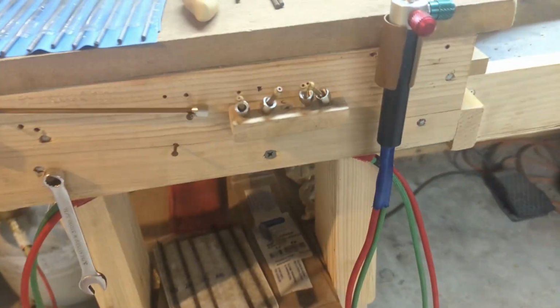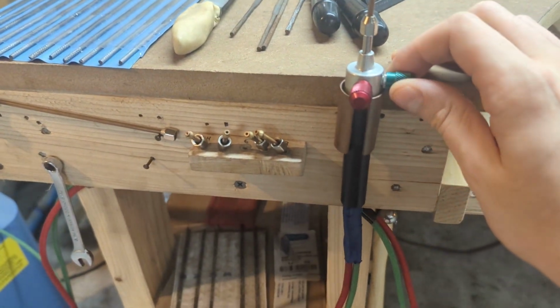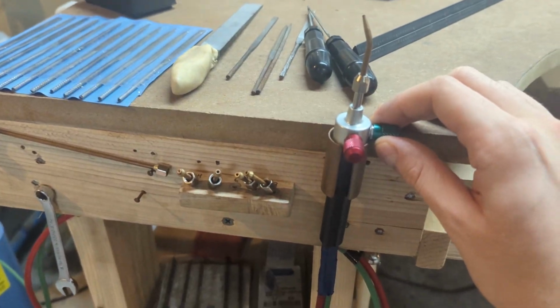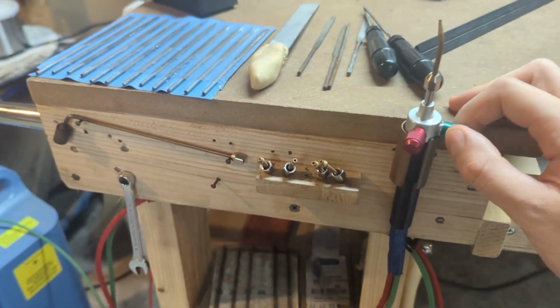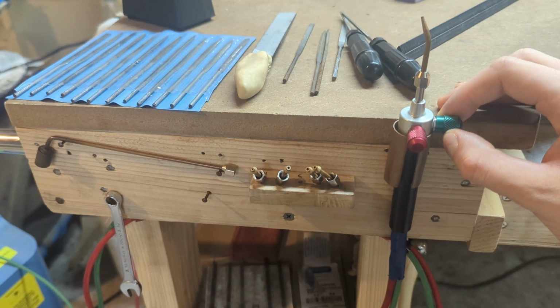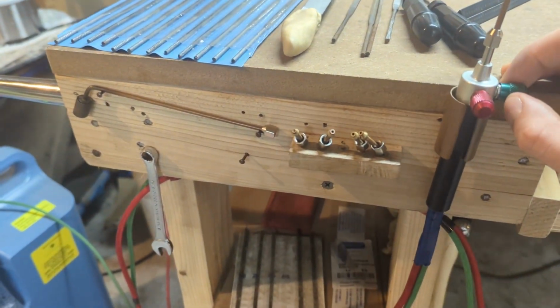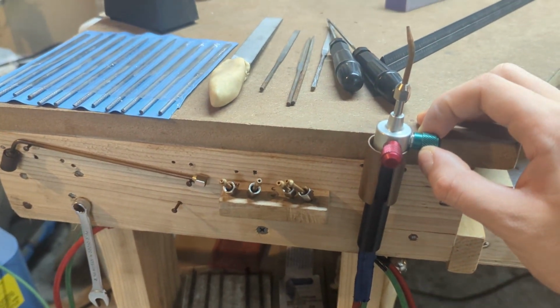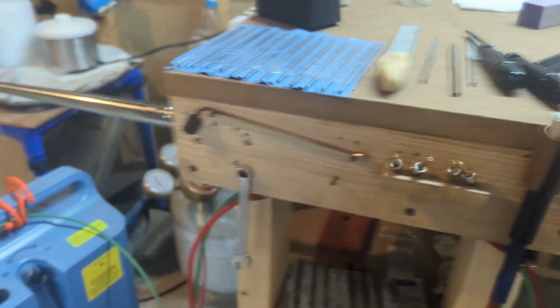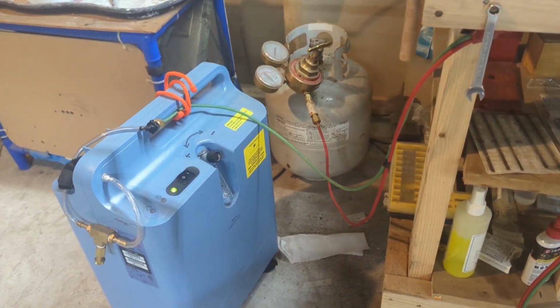And it's just overall bad. That's really a problem when you're making jewelry, because you can't have the oxygen closed for extended periods of time, so you always have to be mindful of that. It's just another thing you have to worry about. And also, even if you want a really oxygenless flame, you're going to want just a little bit of oxygen. And even if you are using just a little bit of oxygen, that can still back up the system and set off the alarm, and it's just not good.